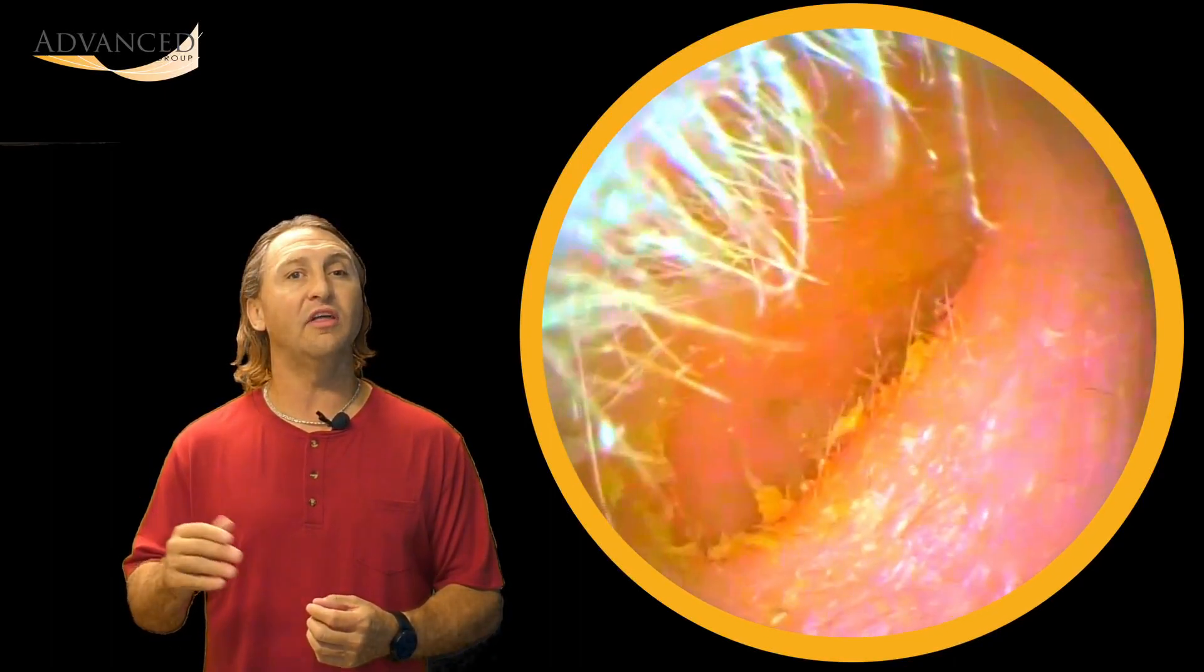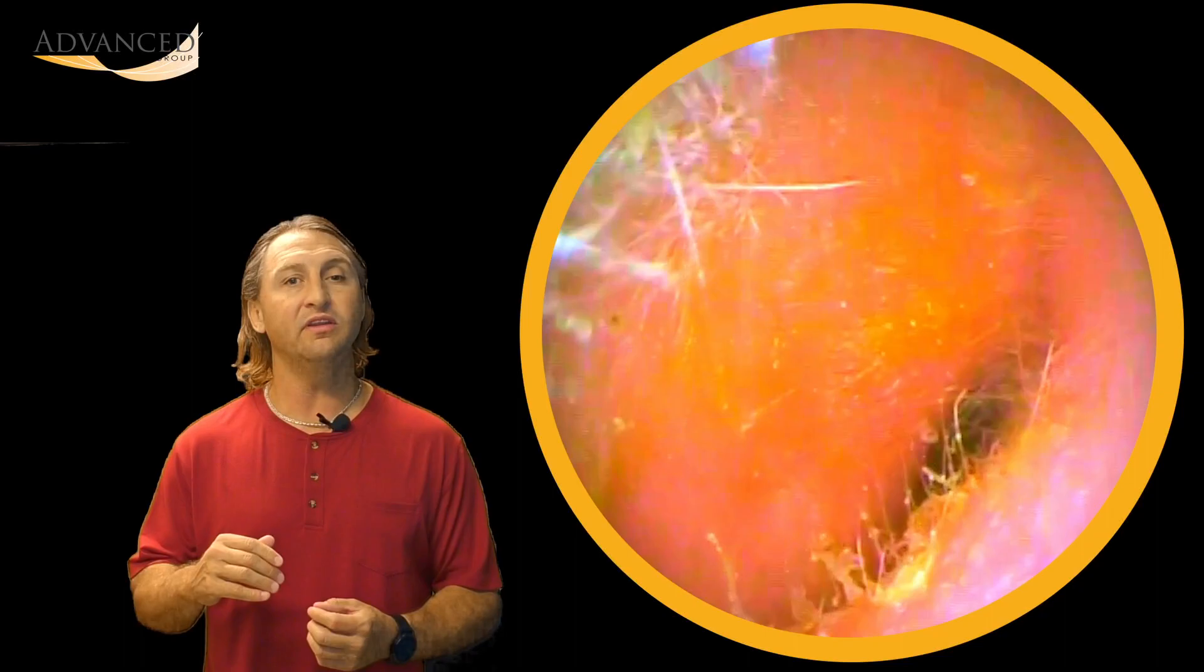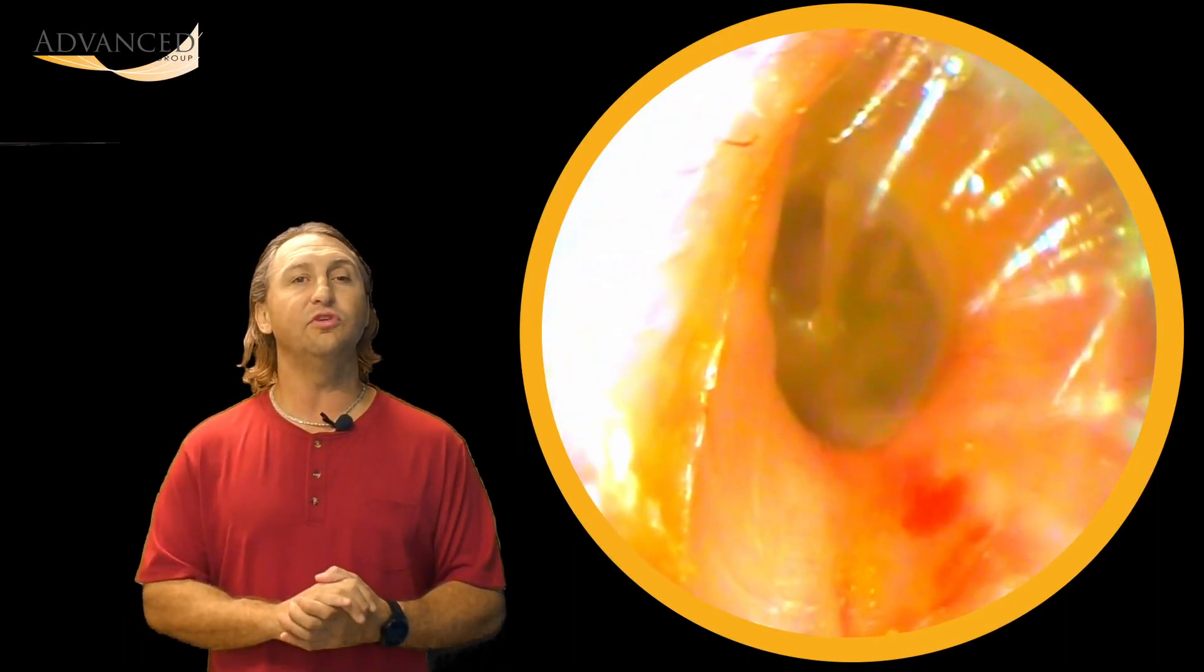Again, here we go. We're gonna pull on the pinna. You're gonna see the ear canal open. And as we put the camera in, it presses that ear canal to the side and we get a good view of the eardrum.